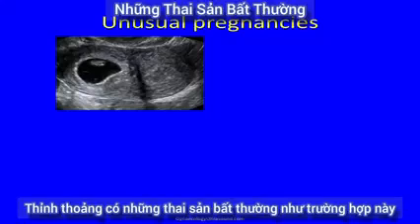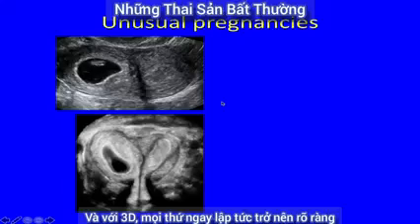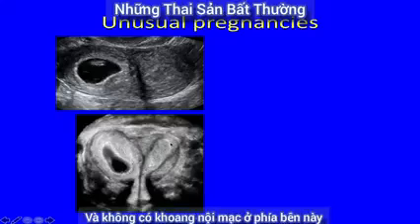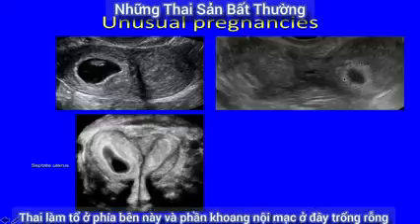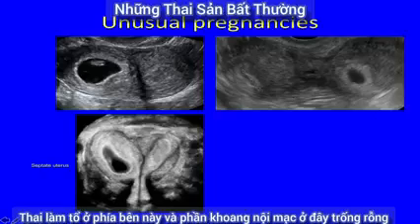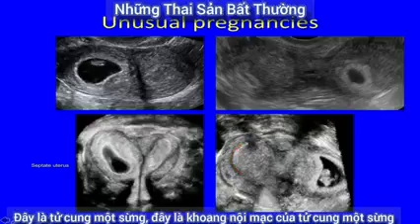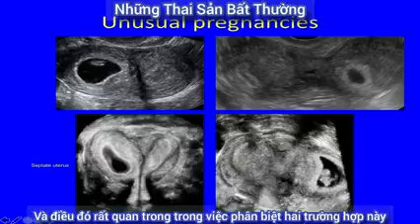Sometimes pregnancies are unusual, as in this case where you've got a pregnancy in one horn and an empty uterine cavity on that side. On 3D it was instantly obvious that this is a septate uterus, with the pregnancy in one horn and an empty endometrial cavity on the other side. That's a very different scenario to here, where the pregnancy is on one side and the empty endometrial cavity is on the other — and on the 3D view you can see this is a unicornuate uterus with a pregnancy in the rudimentary horn. How important to be able to tell these two apart.